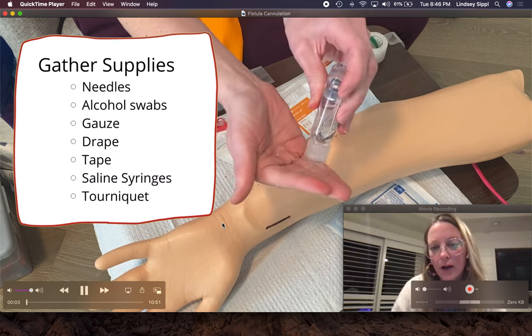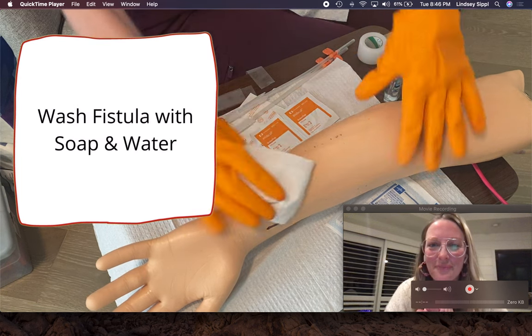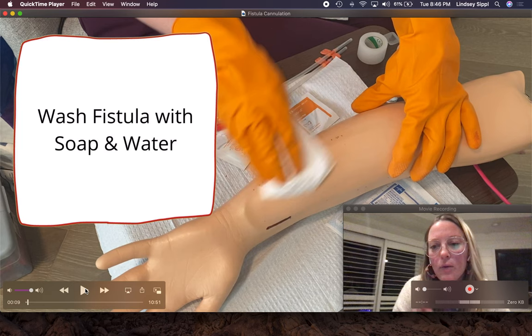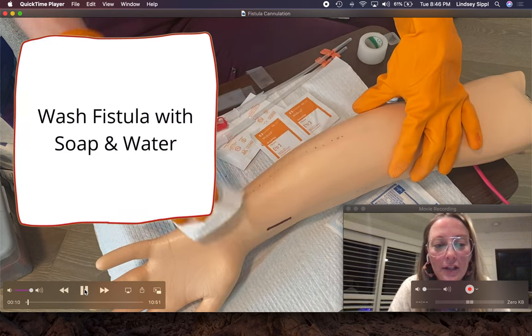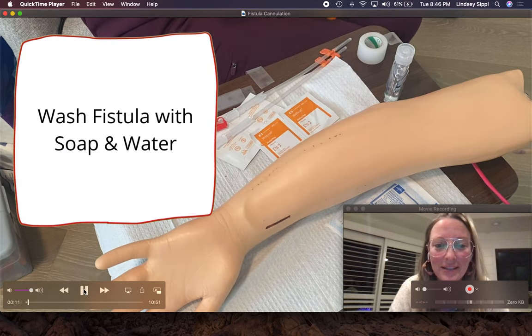Just like everything everywhere, we will start by cleaning our hands. For patients that can walk into the facility, they will stop at the sink and wash their fistula with soap and water. Usually if they're in a wheelchair or if they have problems with dexterity, we will wash their fistula arm for them in the chair.